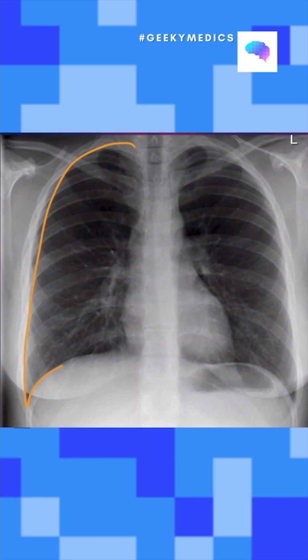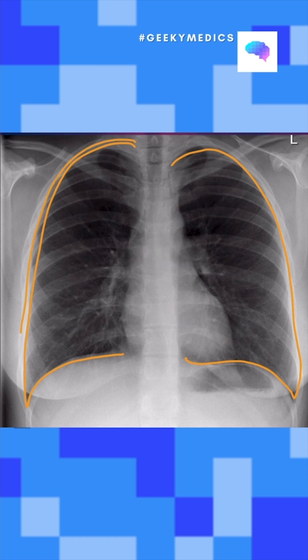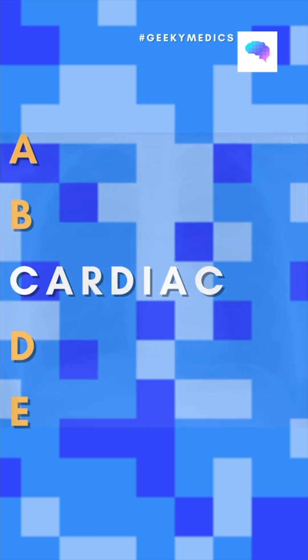B is for breathing. We want to look at the lung fields and make sure that we compare left to right for the upper, middle, and lower zones. We also want to look at the edge of the pleura.